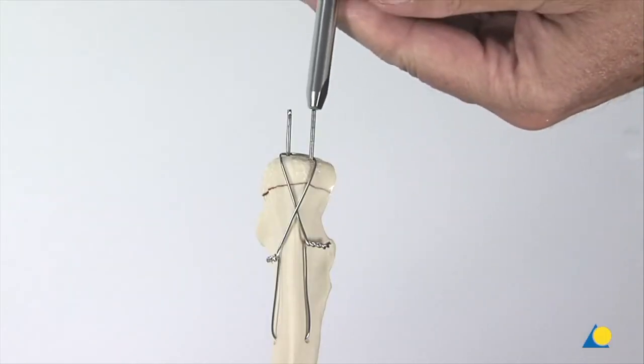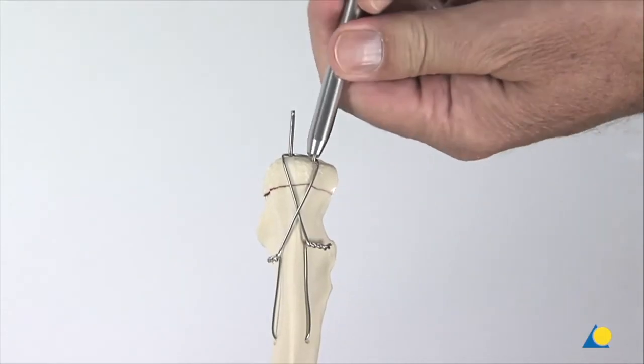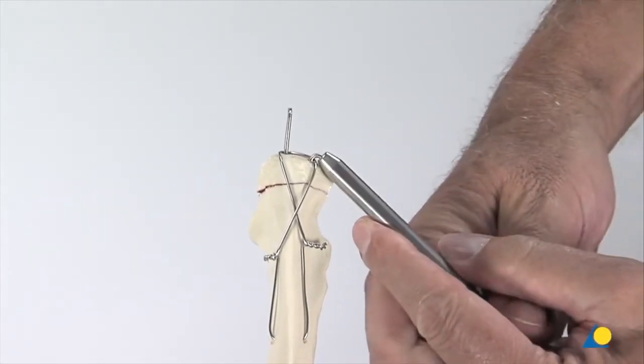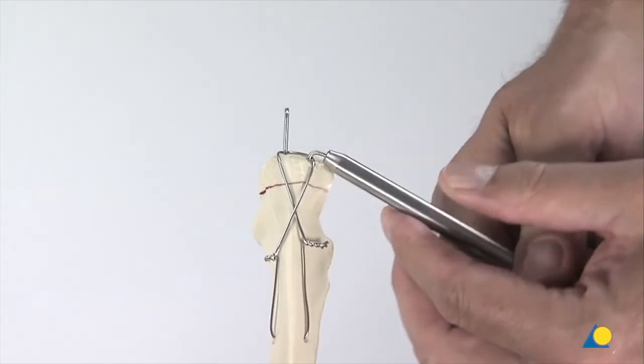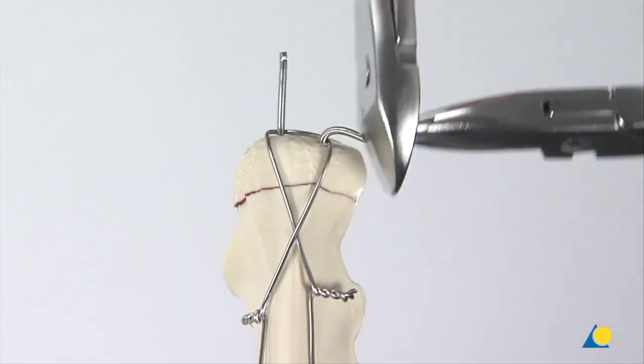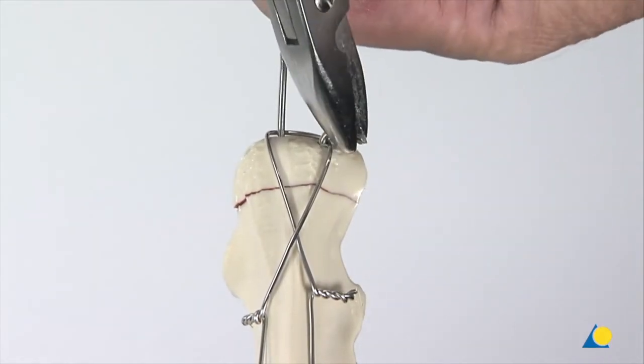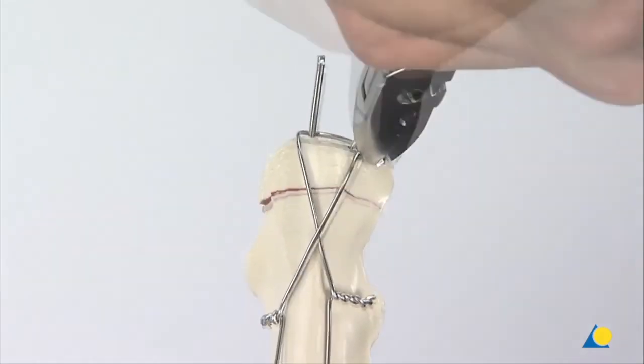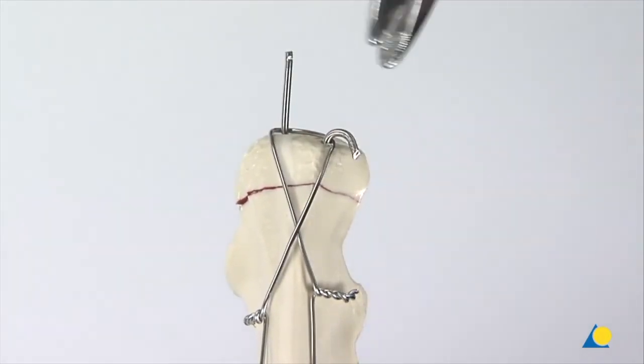With the wire bending iron, the K-wire is bent approximately 120 degrees. The K-wire is trimmed with the wire cutter. The K-wire is then bent further using the wire bending pliers so that the end of the wire can be inserted into the bone.